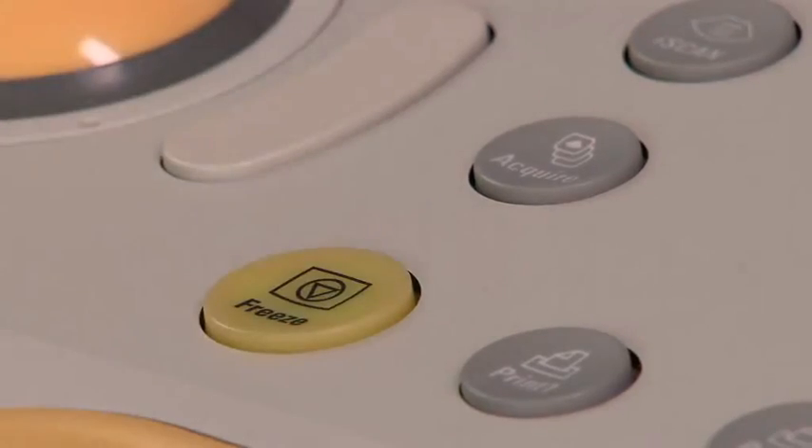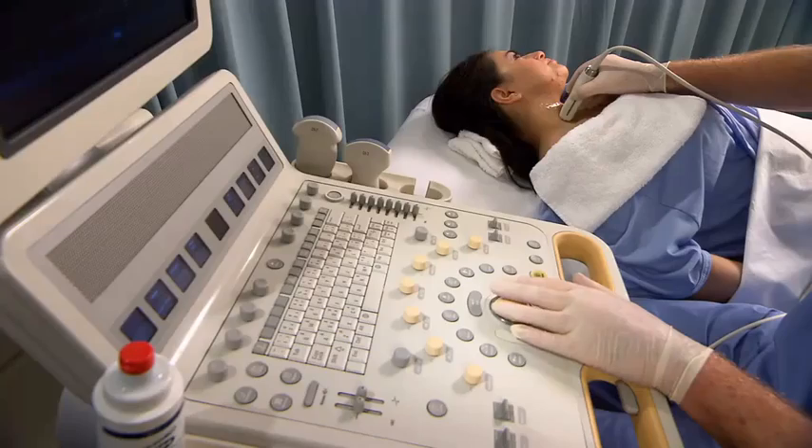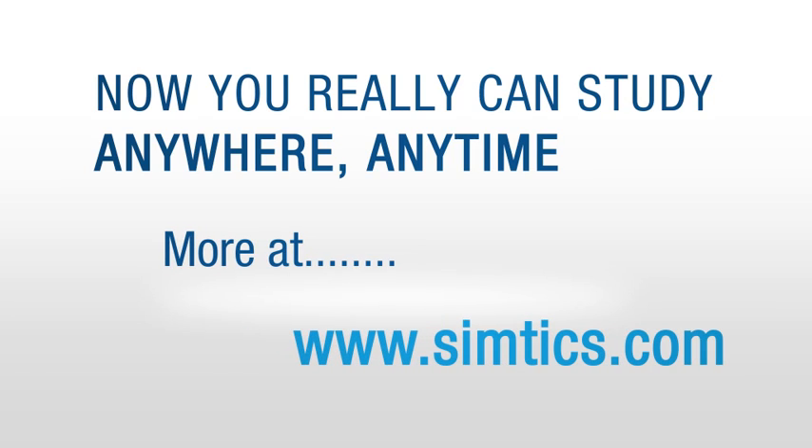Freeze the image. Annotate the scan plane, patient position, and structures identified. Measure the maximum width by placing the calipers on the medial and lateral aspect of the widest part of the thyroid.